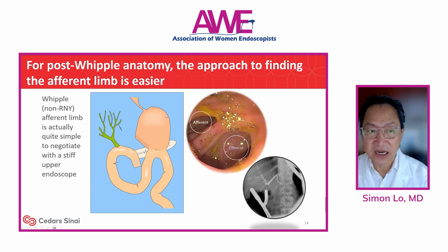Not all the anastomoses are difficult. The Whipple cases are quite easy to find your lumens because, one, you have only 2 lumens instead of 3. Second, the afferent limb is usually predictably at the top and to the left side, so it's like around the 10 o'clock position. And roughly 90% of the time, that's the orientation you will know that's the afferent limb.